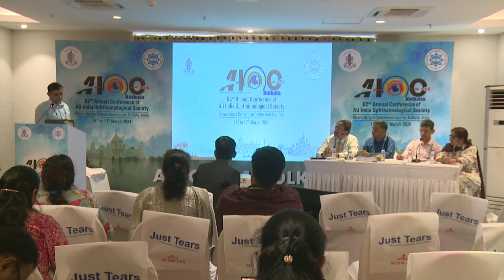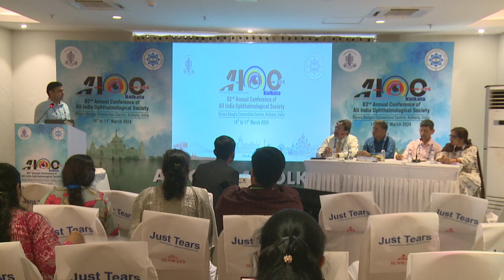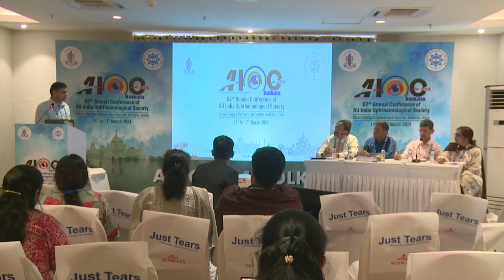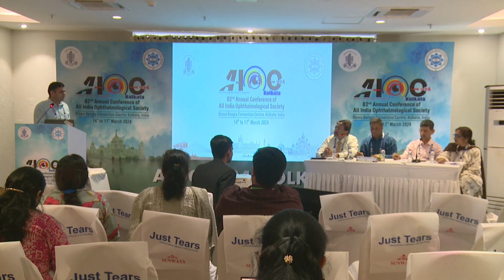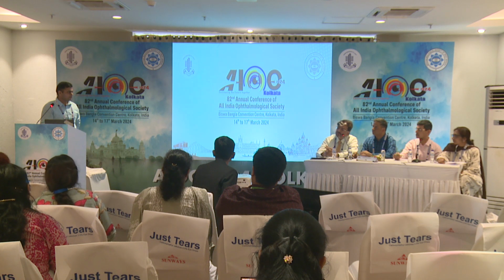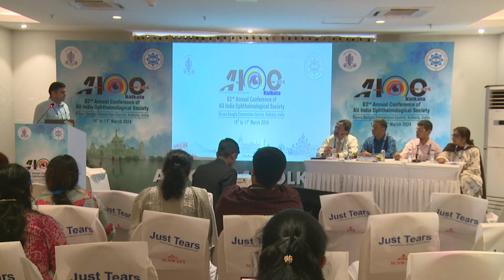But till now, sir, we are quite comfortable, and the number of patients on whom we are actually taking gonio photographs has increased, sir. Because it is so easy to take photographs; earlier we were so lazy that we did not take them. We used to skip on busy days in the OPD. The patient is cooperative. It's like applanation tonometry, sir. We just anesthetize with one drop of proparacaine eye drop, and then you can get your gonioscopy photograph done, sir.